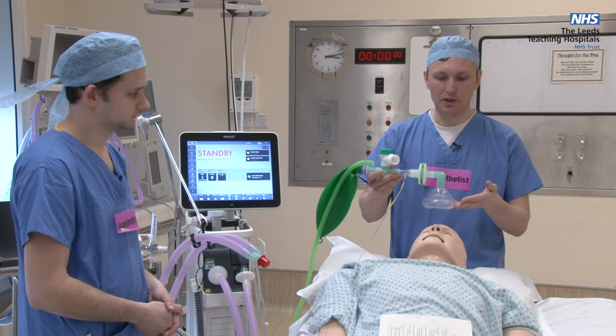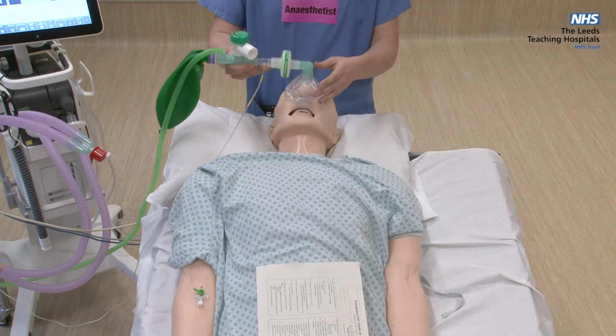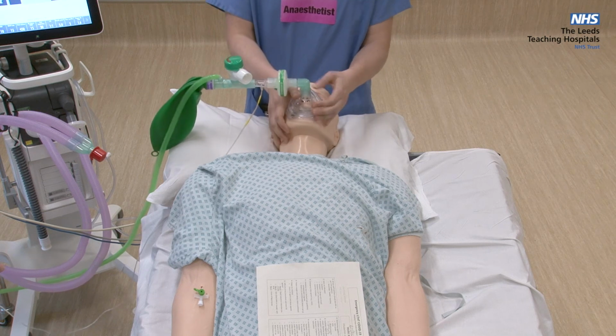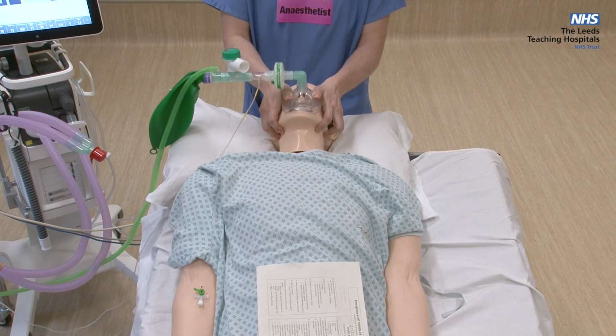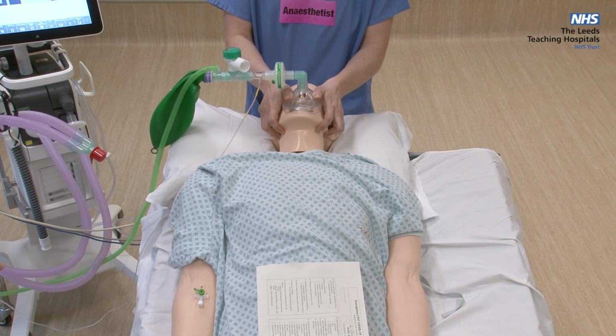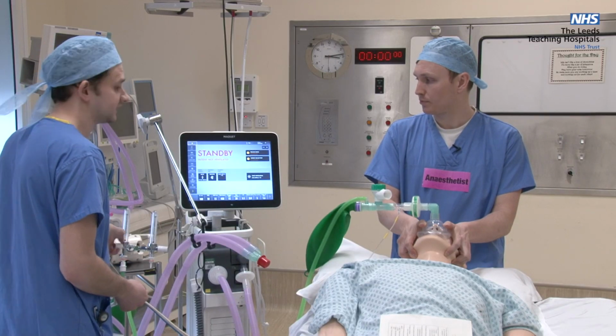So the first thing I'm going to do is place the mask without any oxygen flowing through it onto the patient's face. So I'm going to apply that with a V-grip as shown in the intubation guidance. Once that's applied and I've got a tight seal, I'm then going to ask Paul, who's our assistant 1, to turn on the oxygen flow to the Mapleson C circuit. So can you do that now please, Paul? So oxygen on, 15 litres.